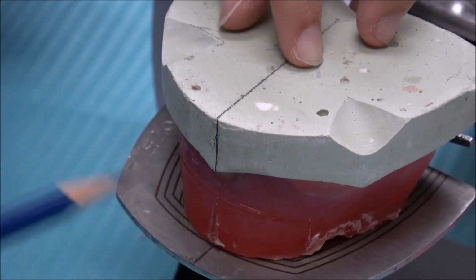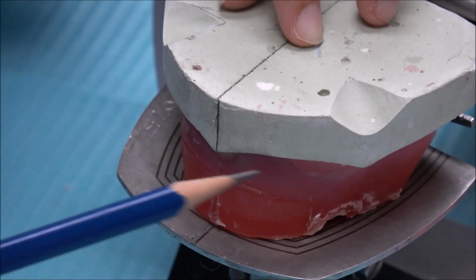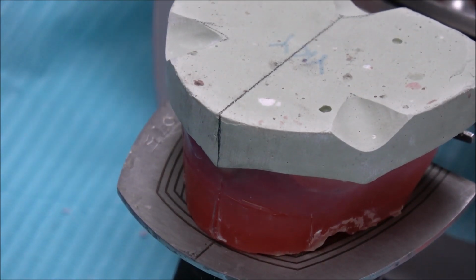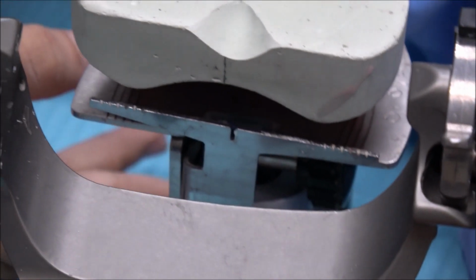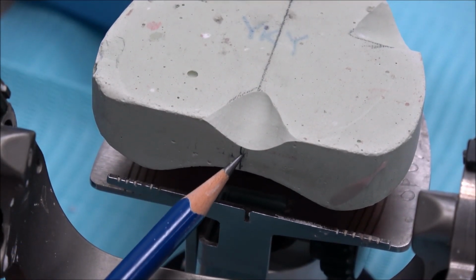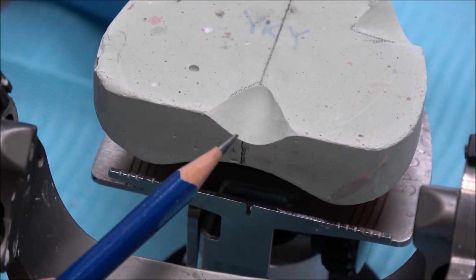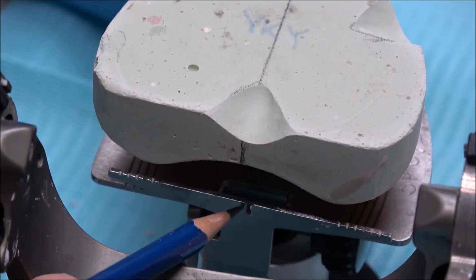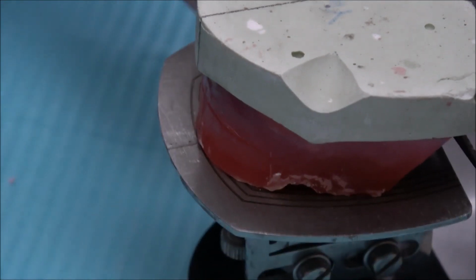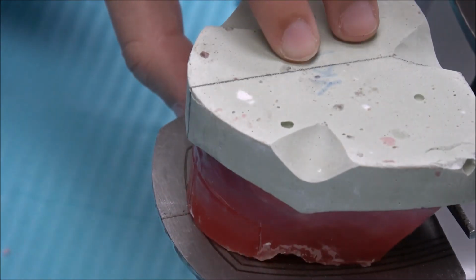So we have to balance. If the left hand side is on the second line, so here will be the second line. Okay, so we just balance it. After that, we have to check the behind line, the back line. Can you see? So make sure the line we draw here follows the line. There is a hole here. Can you see? So we will be straight to the line here. Okay, after we make sure our position is correct, we have to seal it with our sticky wax.